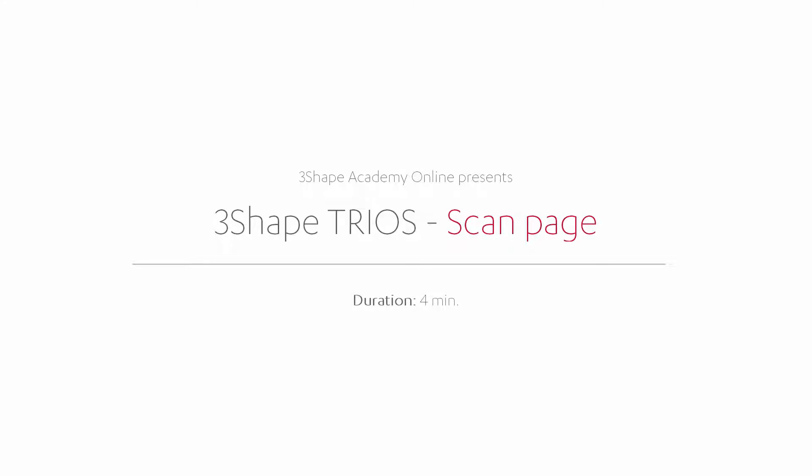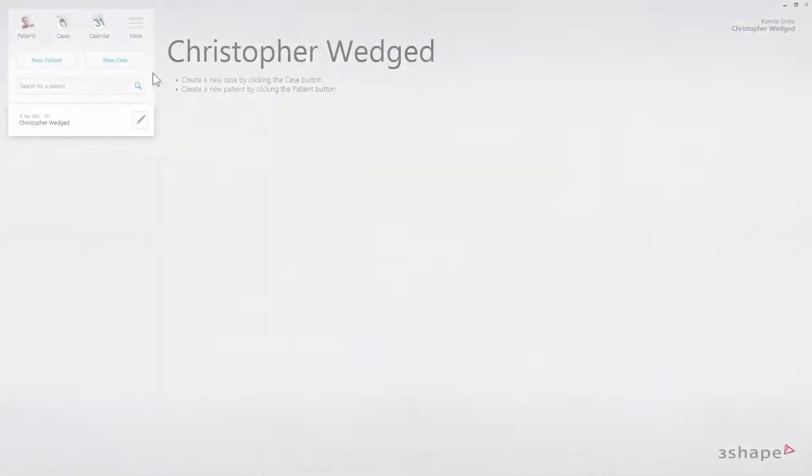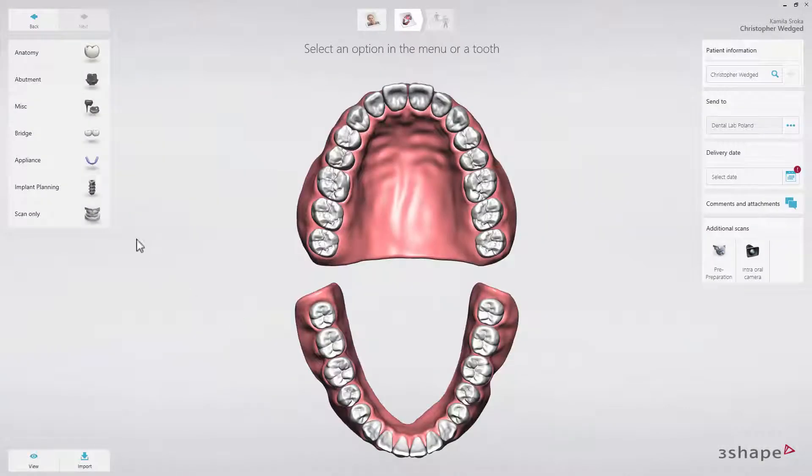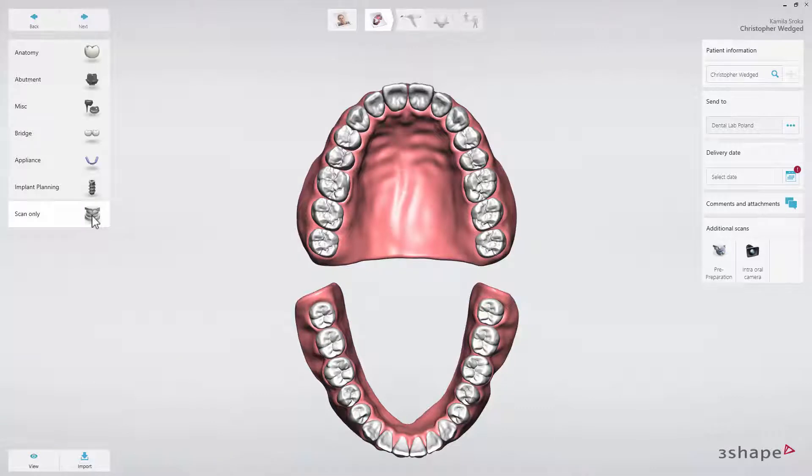In this video you will learn how to navigate the 3Shape TRIOS scan page. Once you have selected or added a new patient, created a case and chosen the type of restoration, you are ready to start scanning.